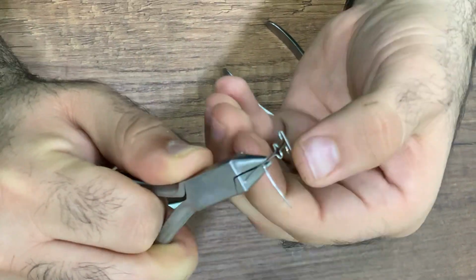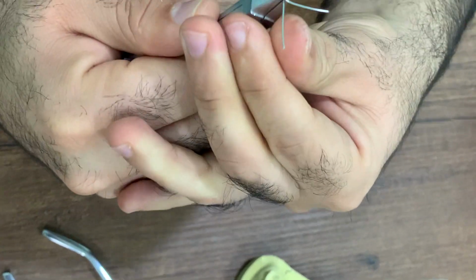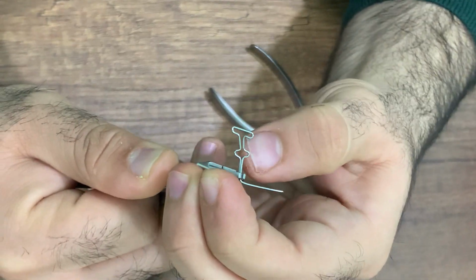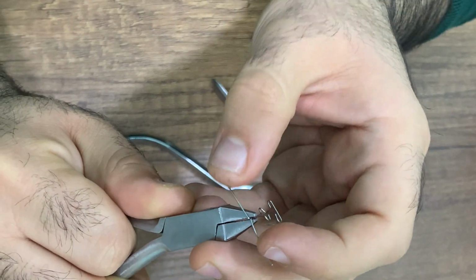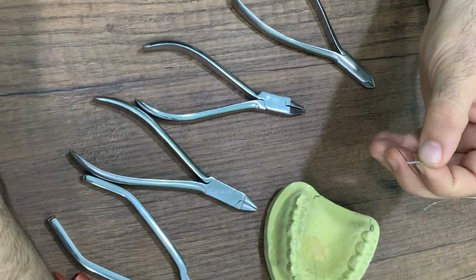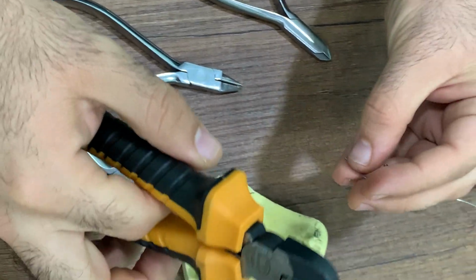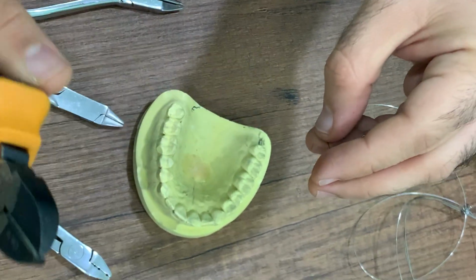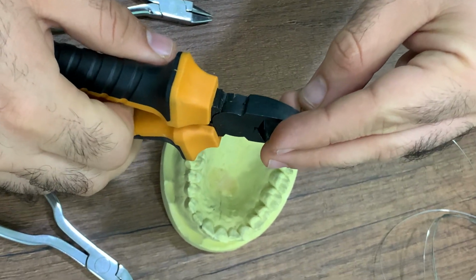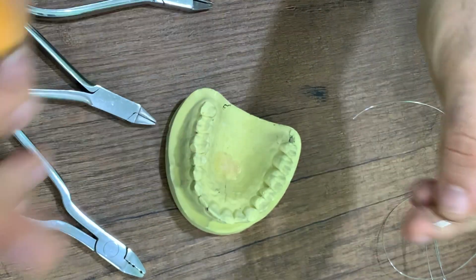And we cut the excess length of the wire, as I said, to cut the wire safely. Hold the wire between your fingers and cut to avoid having any wires fly away.